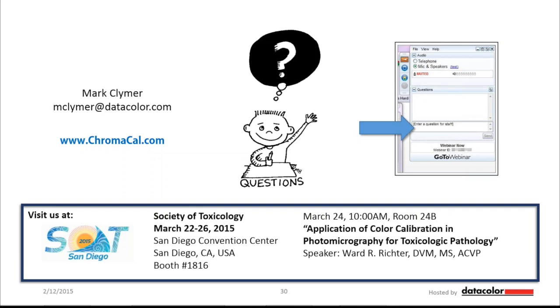Definitely, probably even more so, because there are a lot more variables there that will affect linearity, especially if we have multiple users using the same microscope, and everybody kind of changes settings on your system. So once you start taking images, you really don't know where you are, and checking that with the calibration slide, I think, is even more important than with a whole slide scanner, which has a limited user base.